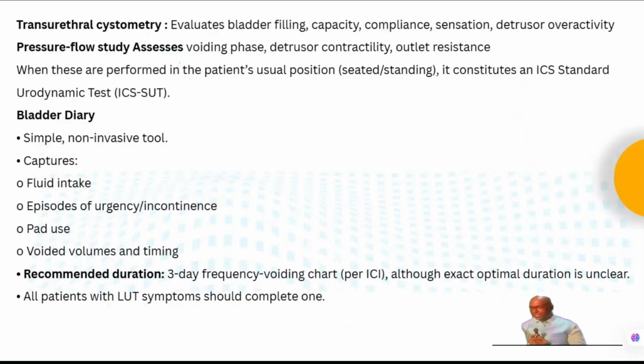Okay, so these tests, when they are performed in the usual position, that is seated position or standing position, will constitute ICS standard urodynamic testing. Now, what is the bladder diary? That is one of the prerequisites before we proceed with the urodynamic testing. We need to have the completed bladder diary.